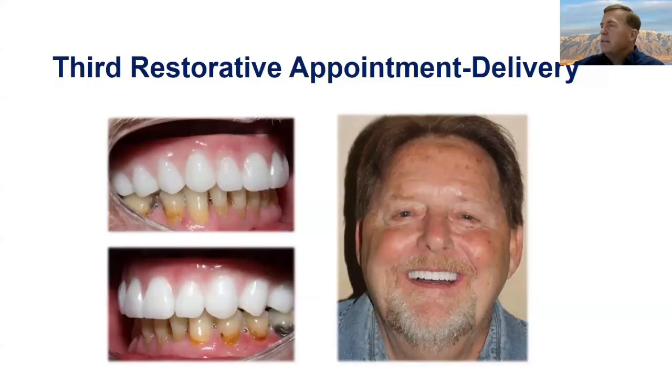Third appointment, deliver it, woohoo! And we've kind of been going from the person who started with really bad teeth. We zeroed in quite a bit with the provisional, and then we zeroed in even more with the prototype. So now we know what the patient wants, and we had that on the screen when we did the design, so it can be predictable that the patient's going to get what they want.